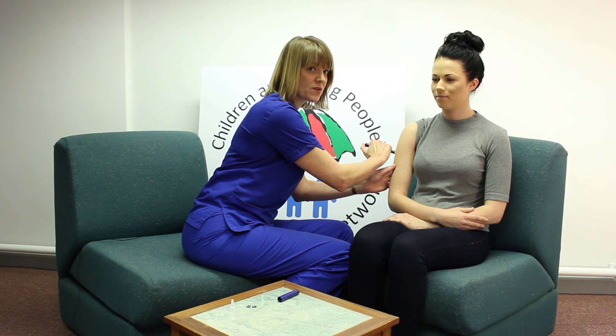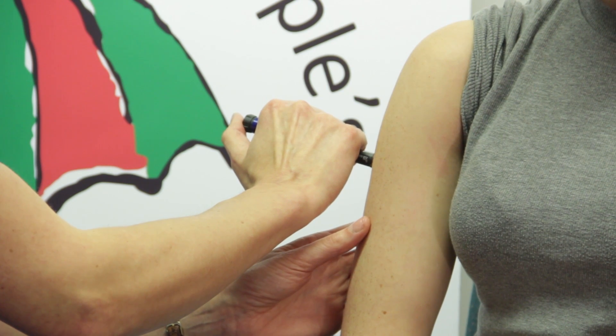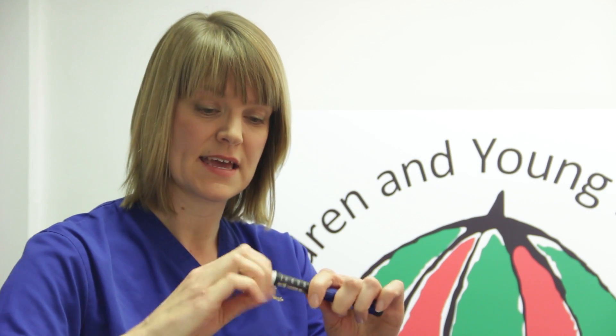Count one, two, three, four, five, six, seven, eight, nine, ten, and then safely remove the needle from the skin. Take the big outer cap, put it onto the top of the insulin pen needle, and unscrew. This needle can now be disposed of safely in the sharps box.